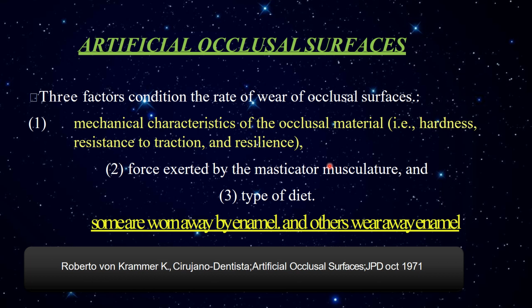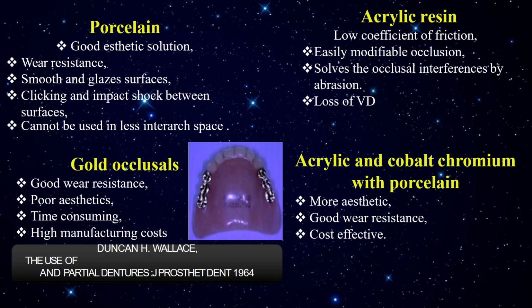Only thing is, by using high impact denture base resin and using high quality denture teeth like interpenetrating polymer network teeth, IPN teeth, we can reduce this amount of attrition of the denture teeth. And as I mentioned, the patient has to be responsible about his diet, and proper balanced occlusion needs to be given in such cases, so that way we can avoid denture teeth wear.